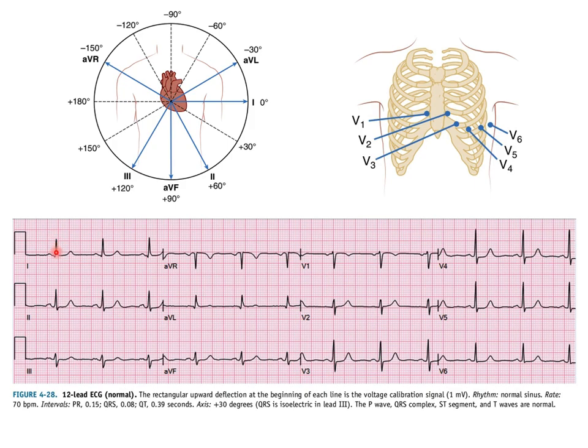The polarity of this voltage is shown here in a normal heart. If these polarities start moving around, i.e. the voltage pattern starts rotating to a different orientation, that's an indication that there's something wrong in the heart, like there's a patch of muscle that's not depolarizing. And so people get very good at reading these strips and deciding, yes, this is a heart attack, and I believe it's in the inferior wall of the heart based on the ECG.